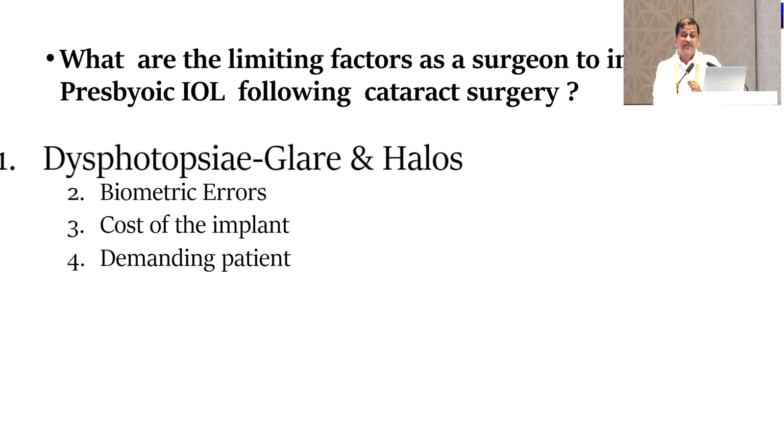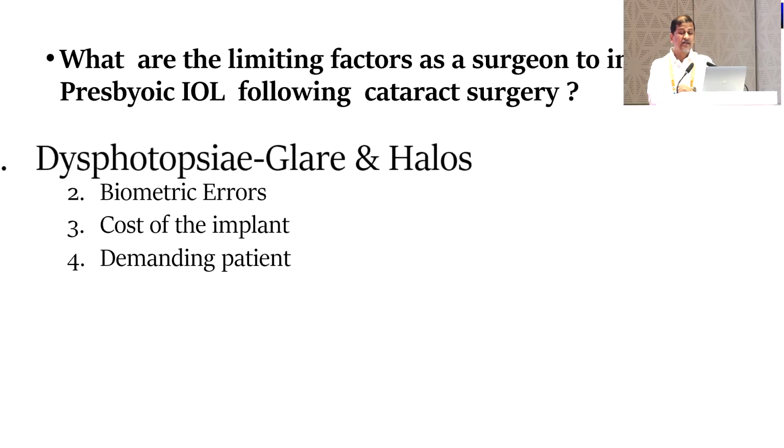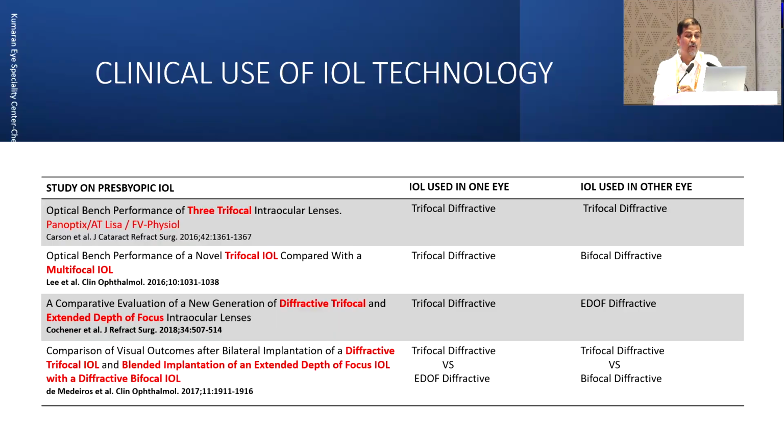And out of this, the reason why most of the surgeons do not implant a presbyopic correcting IOL is because of the dysphotopsia, glare, and halos. Now let's look into the literature, what it says by addressing all these factors.